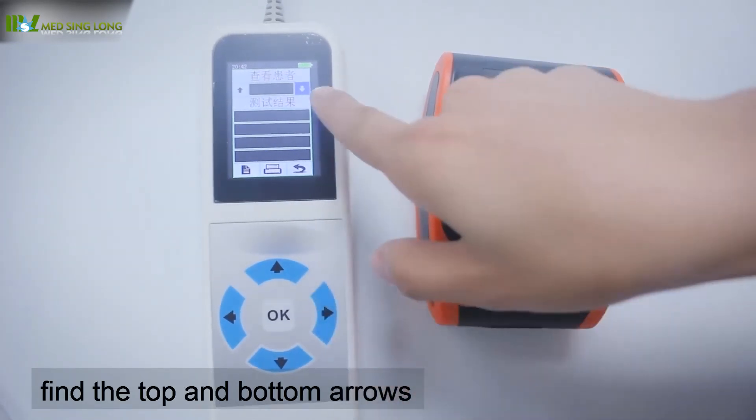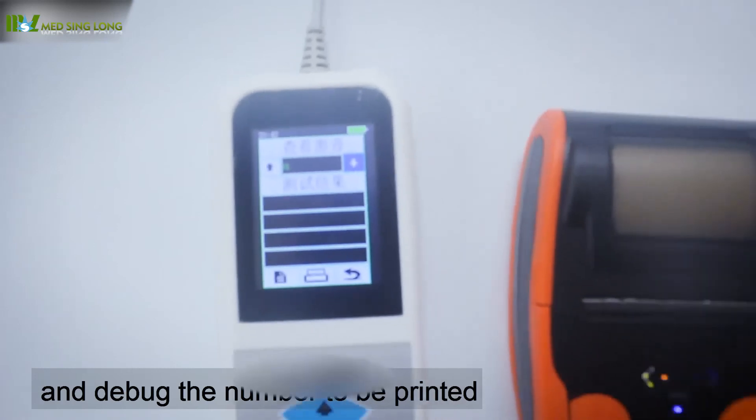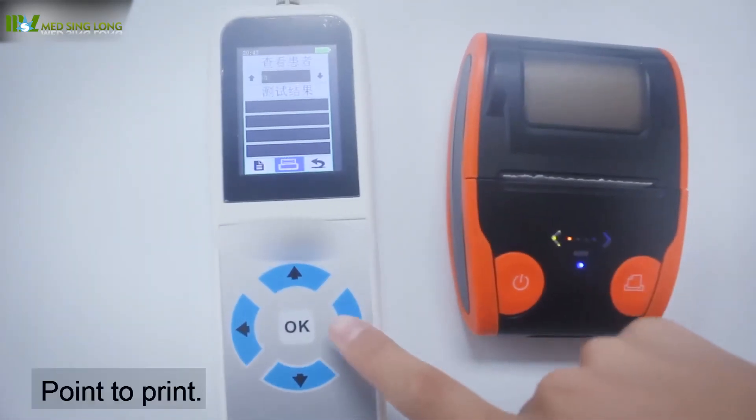Find the top and bottom arrows and adjust the number to be printed. Click print.